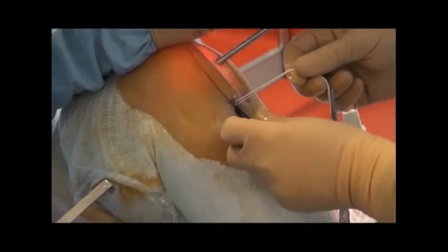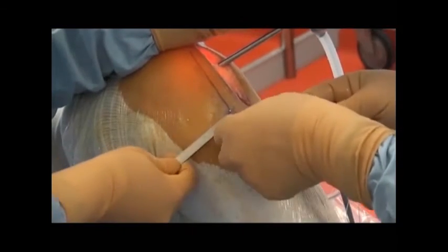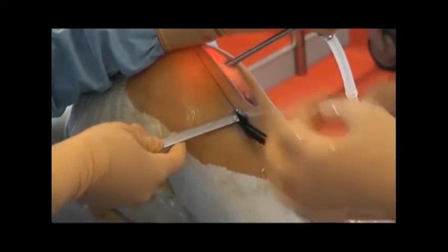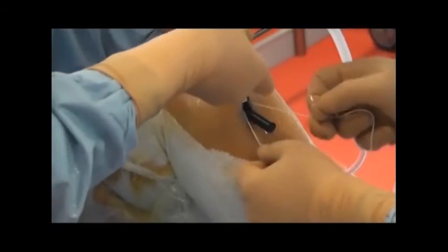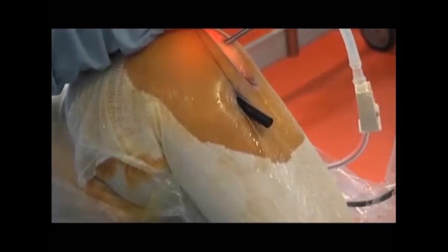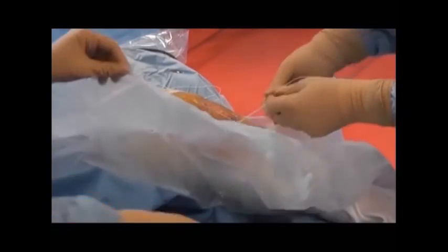Lock the fixation in place on the tibial end. With the knee flexed to 20 degrees, alternately pull on the white threads of the implant until they lock into place. Check under arthroscopy that the plate is properly positioned and repeat the operation if necessary.